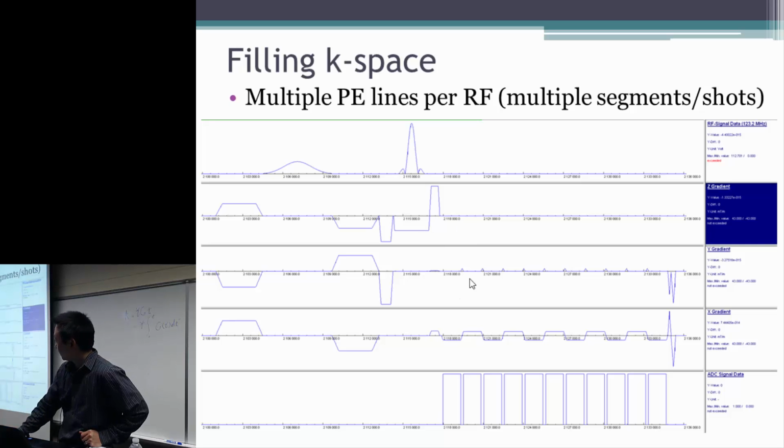I wonder if you can see that there is a small blipping here. They are used for the phase encoding. That means we are collecting different k-space lines here, different phase encoding k-space lines here. We are putting them into the same k-space, and then we have improved the data acquisition by 11 times.